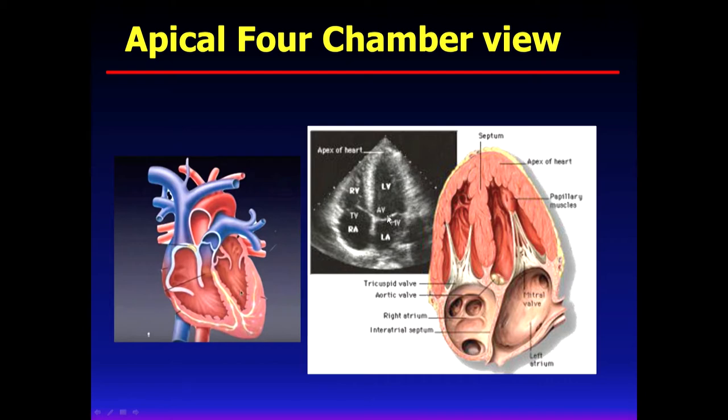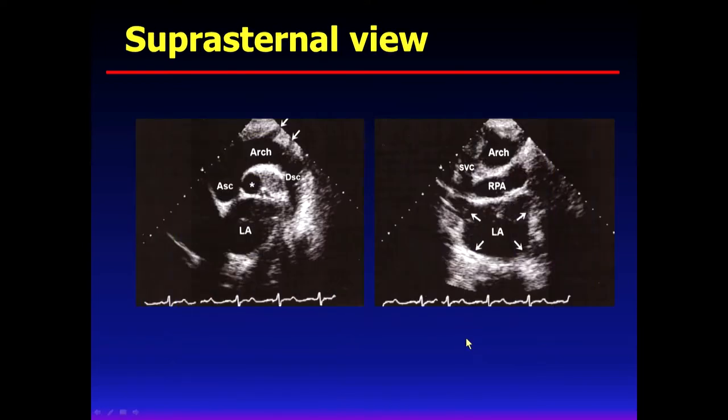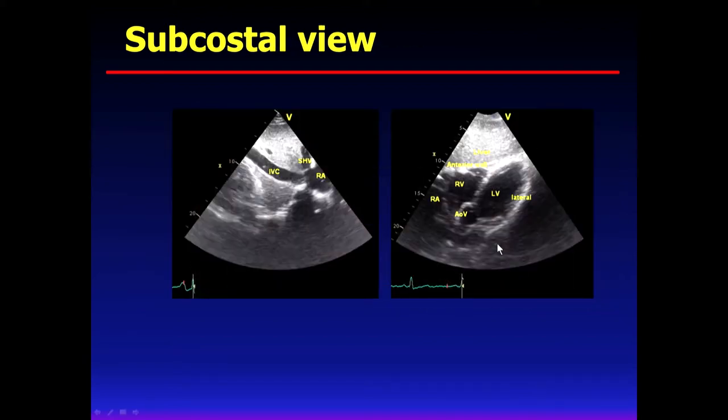But if it has a different connection here, a valve is like below this, and something is in it, we need to find it. And then this is the apical view, 4 chamber, and 3, 2, and then 5 chamber views. And this is a suprasternal view. We are aware of the arch and the other structures, and then make an angle for the pulmonary artery and pulmonary veins in it. So this is very useful for baby kids.